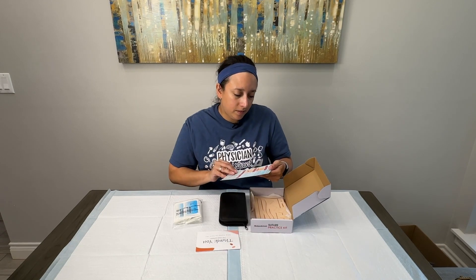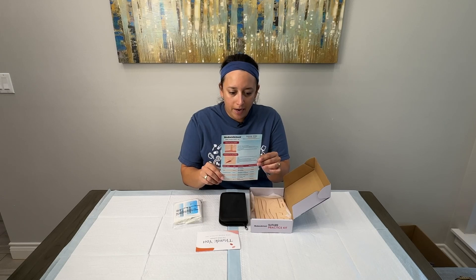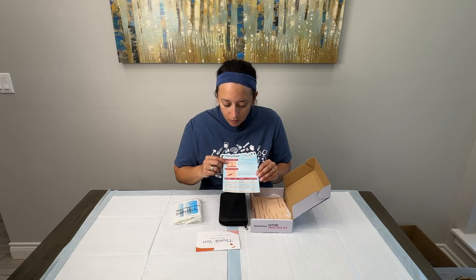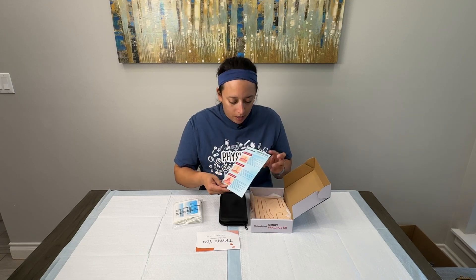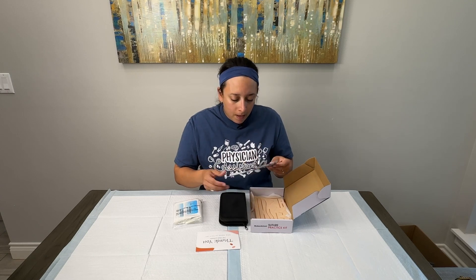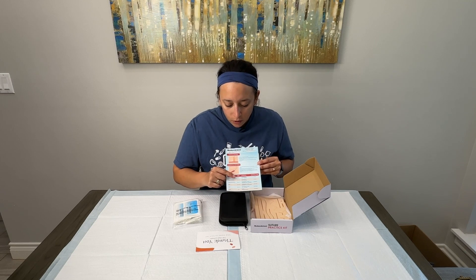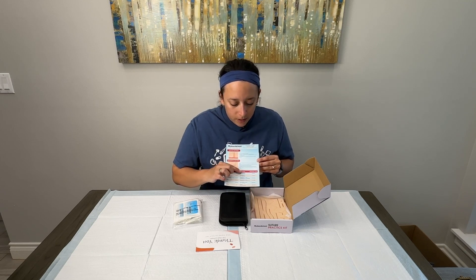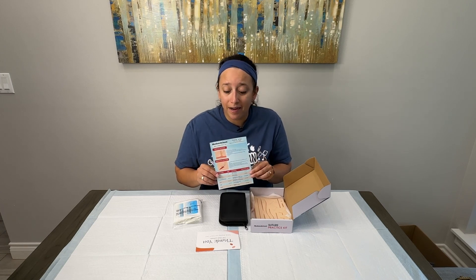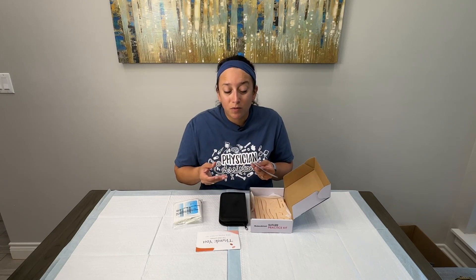We also have a pocket guide pamphlet included that shows the different sutures — vertical mattress, horizontal mattress, simple interrupted, simple running, and subcuticular running. It also shows what size suture is recommended for each body area, what material to use, and how long you should wait to remove it. This is a really handy guide that you could stick in your white coat and take with you on your rotations.